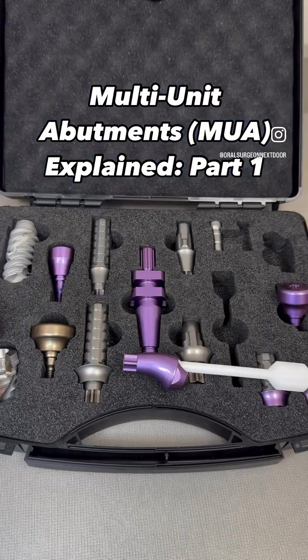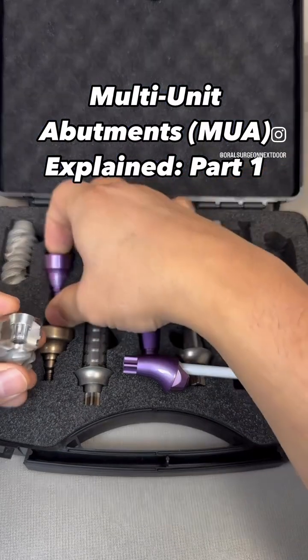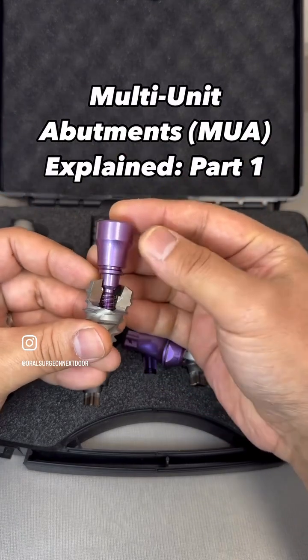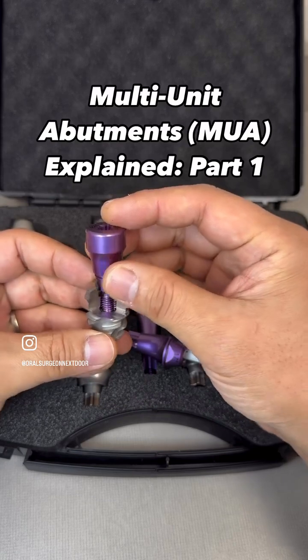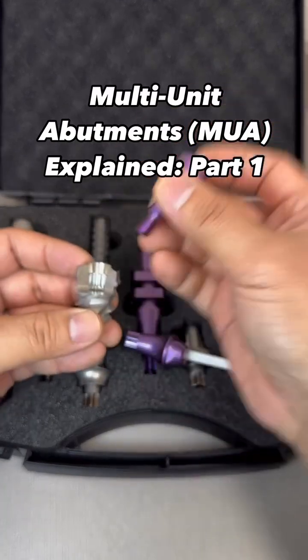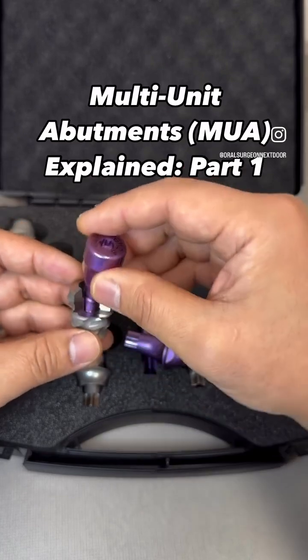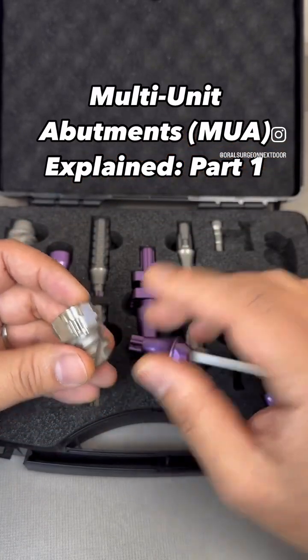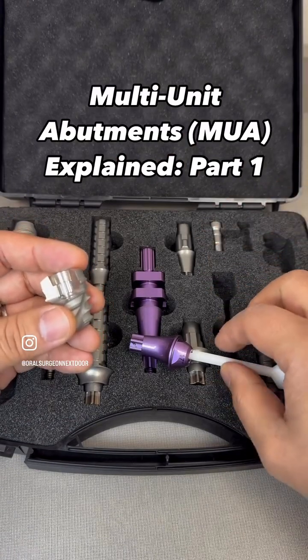Today we are going to talk about multi-unit abutments. It is a prosthetic component commonly used in full-arch dentistry. In a traditional dental implant, you have this straight healing abutment, and you basically use this straight screw axis for the prosthesis. However, oftentimes in full-arch — and not even just for full-arch, but sometimes for single or small fixtures too — angle correction is needed.